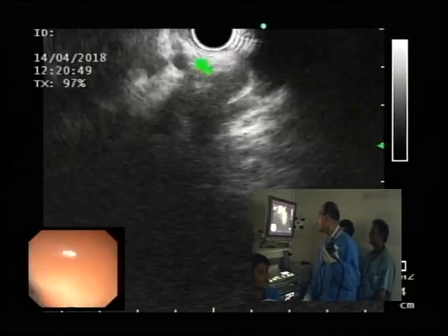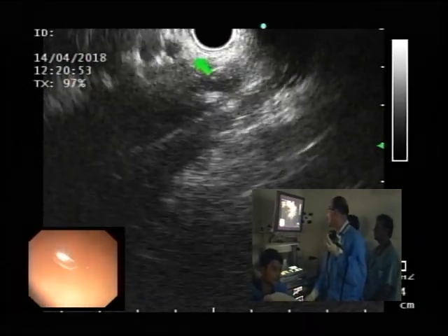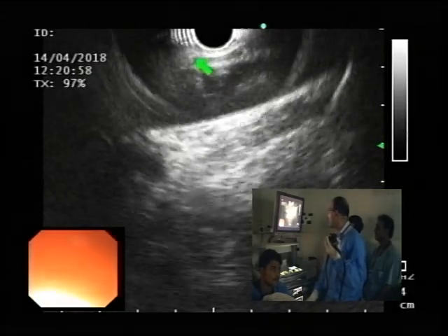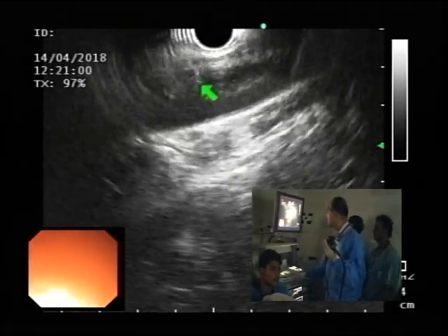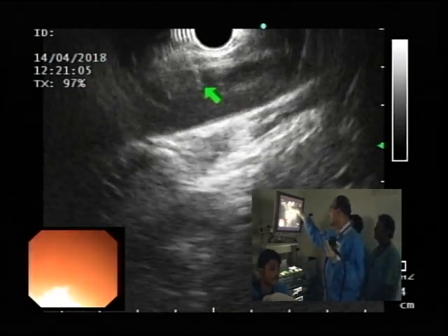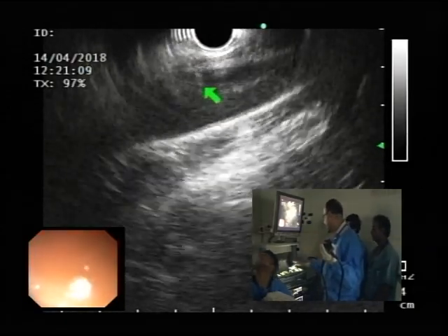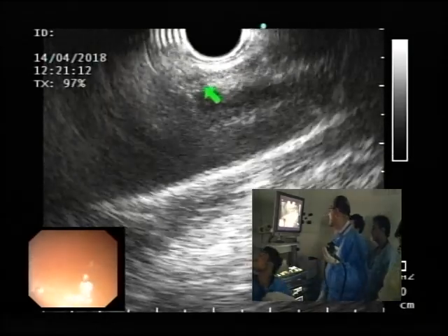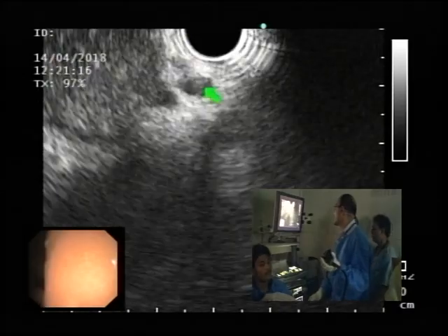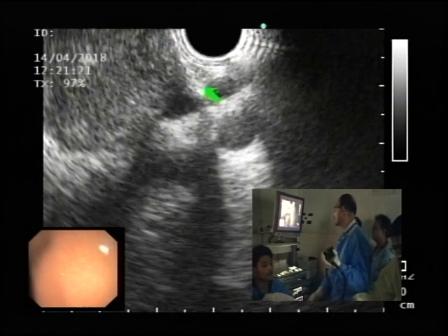As you push forward and you're going counter and clockwise, you will start seeing the celiac. Unlike the previous case, here the celiac is coming off at an angle, which is right where the cursor is. Now, personally, I feel that we're only seeing the valuable information in less than the top half of the screen. So what I'm going to do is decrease my distance so we see more of the pancreas, more of the closer details.